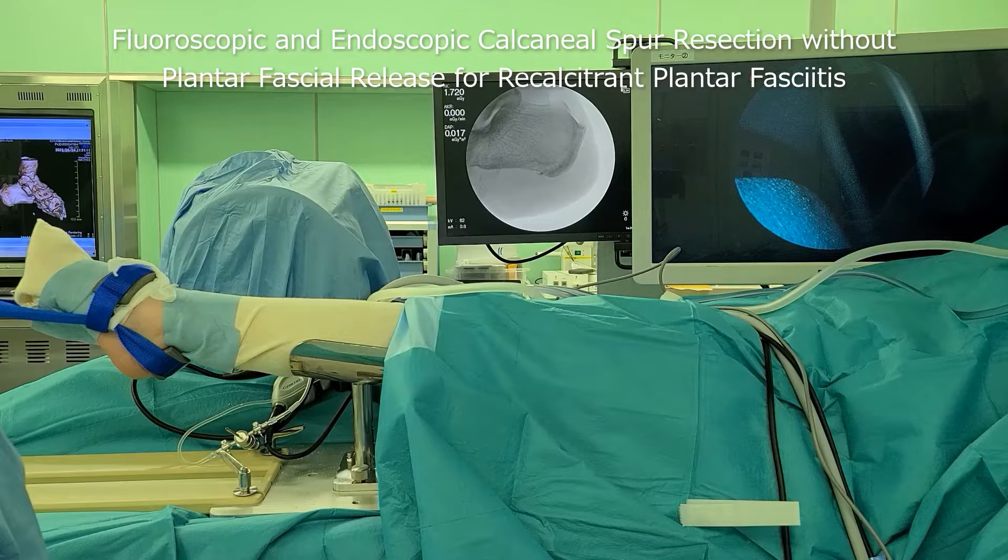Fluoroscopic and endoscopic calcaneal spur resection without plantar fascial release for recalcitrant plantar fasciitis.